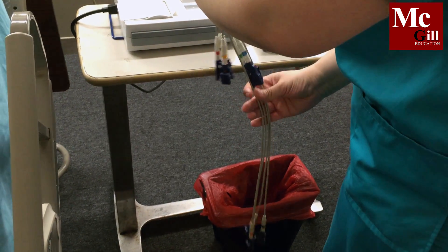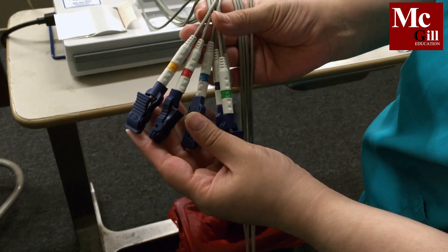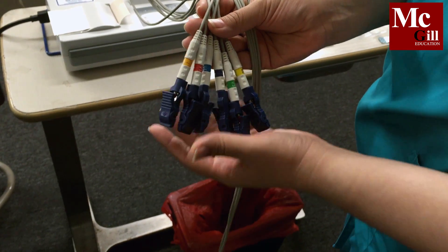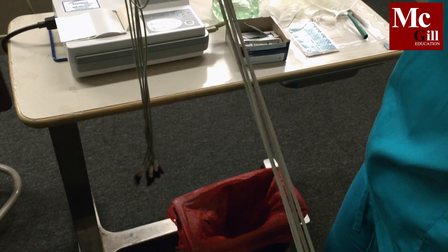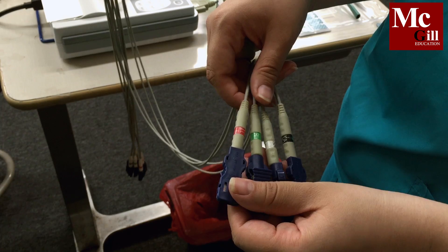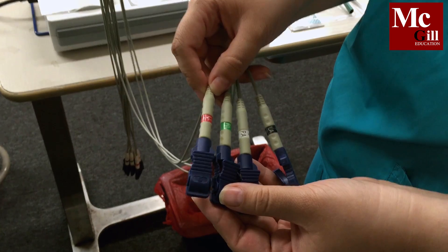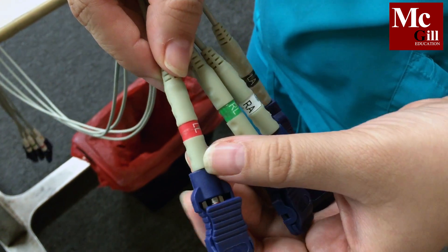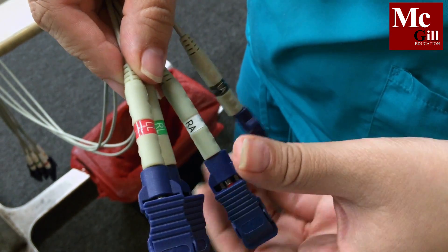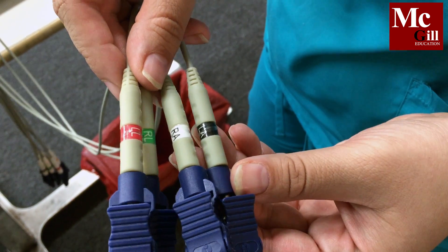The cables are separated into 6 short leads, also known as your chest leads, and 4 long leads, also known as your limb leads. Each lead is described with where the placement should be. For example, LL would be placed on the left leg, RL on the right leg, RA on the right arm, and LA on the left arm.